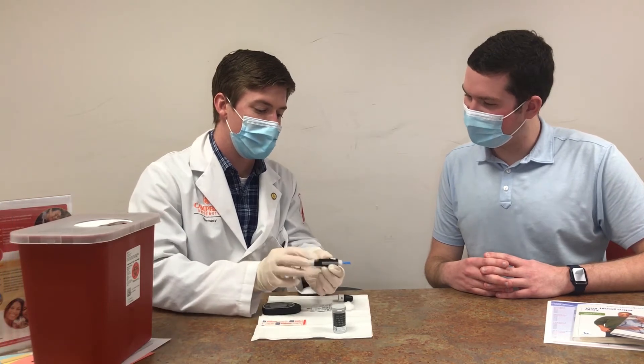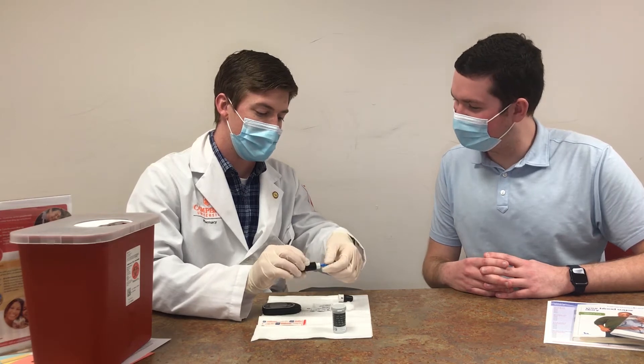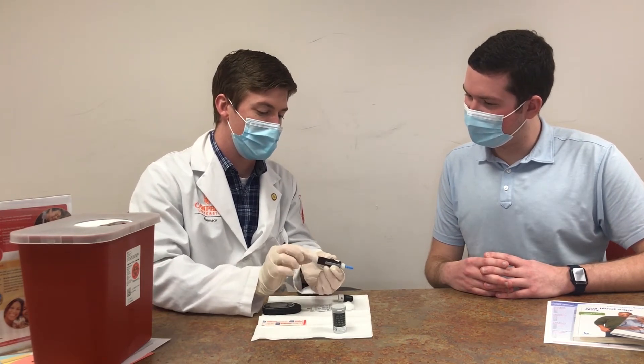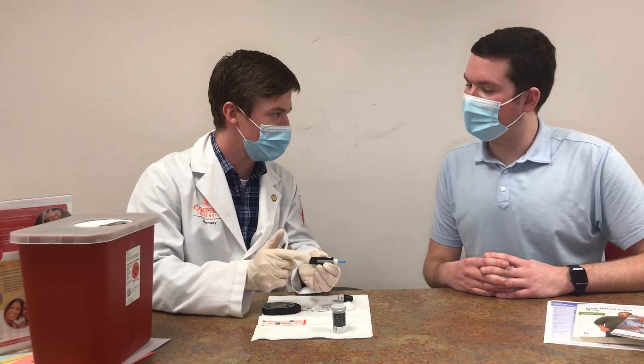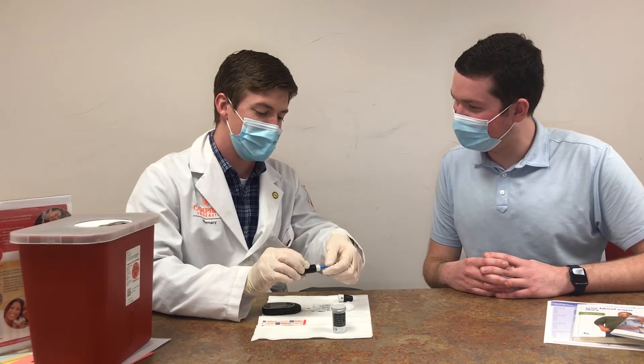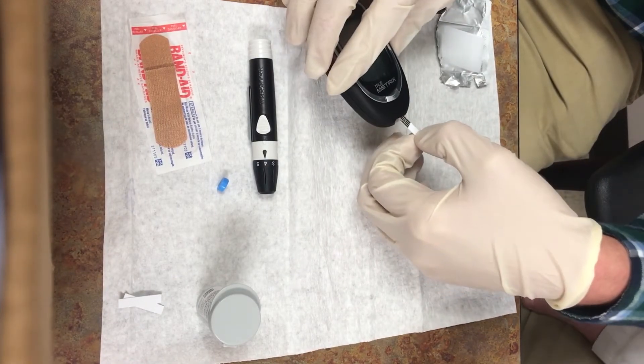Before you begin, lay out all your testing materials so they are easily accessible. Turn on the glucose meter and familiarize yourself with its functions. Each meter is a little different, but all meters perform the same basic functions. Insert a test strip into the glucose meter.